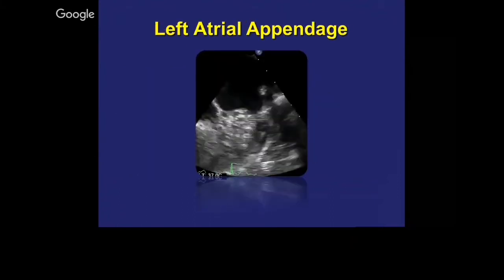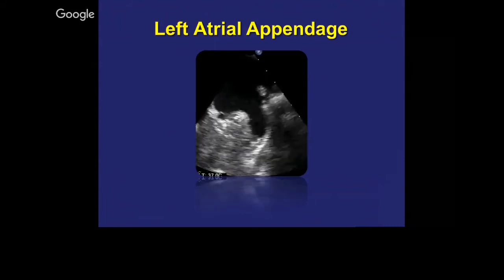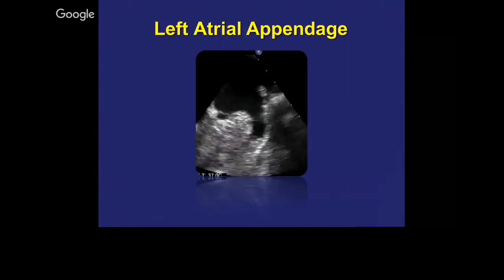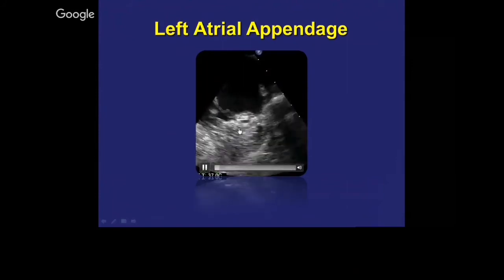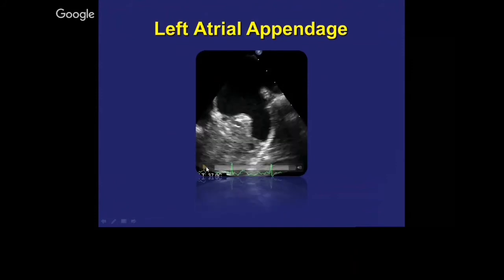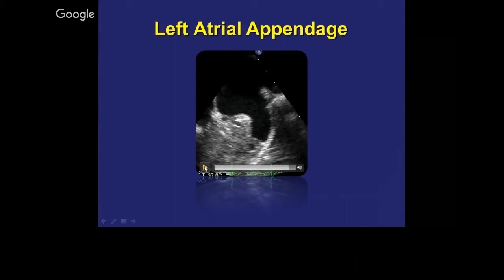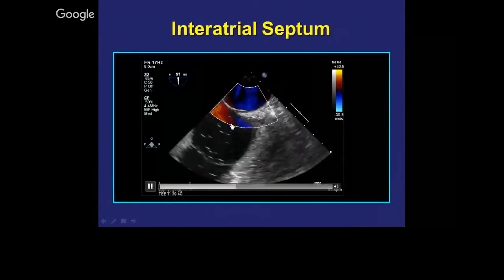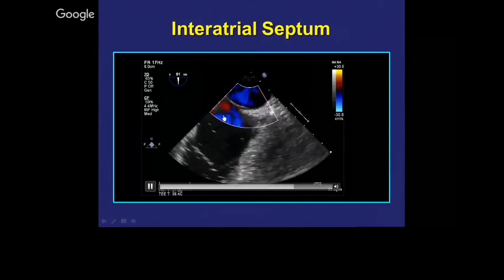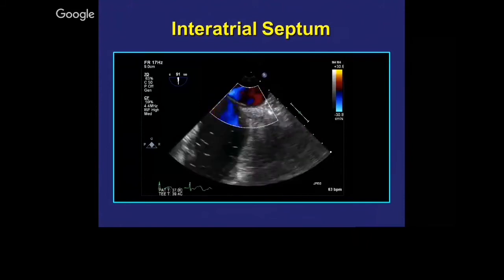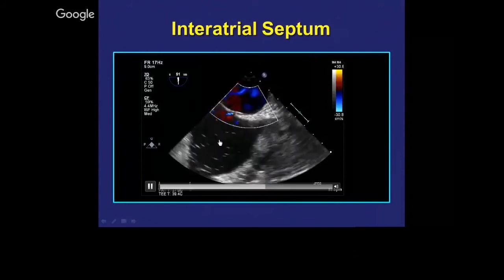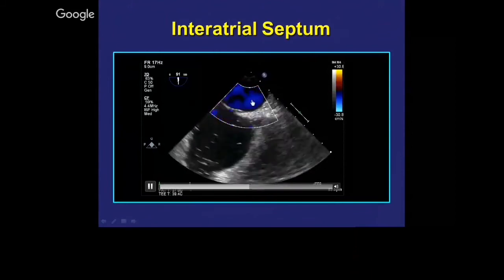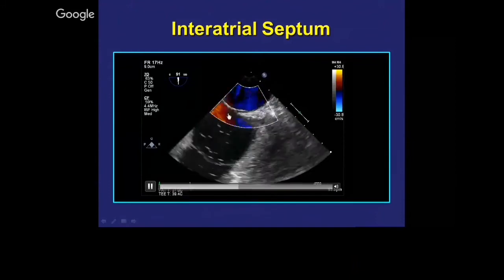A few other things that might interest the surgeon: the left atrial appendage. When you do your MAZE procedure and want to oversew the left atrial appendage, that is what it looks like. You look for thrombus in the left atrial appendage. That small black hole here is the left circumflex in short axis on the TEE. Also the interatrial septum — you're doing your ASD repair, PFO and so on. You can see there is flow going from left to right in this case. Sometimes even with a bubble study, it may be negative, and the only way to tell is because of color flow showing a flow from left to right in the septum.